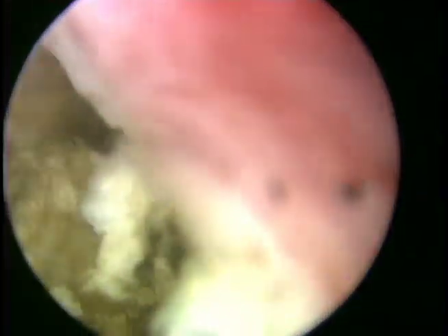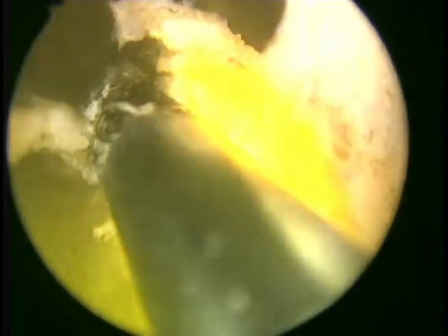However, we do either pure vaporization of the stalks of tissue at their attachment to the capsule, or simply methodically chop these off into small pieces for later retrieval. The goal being, similar to ureteroscopy, to fragment out the debris, which will be later easily removed with minimally invasive techniques. Rather than using a dedicated morcellator, which is truly an intravesical endoscopic surgery, we will break these pieces into small chunks, which will be either removed using a ureteroscopic grasper or simply switching out to a standard TUR loop without the electricity to mechanically pull these pieces out.